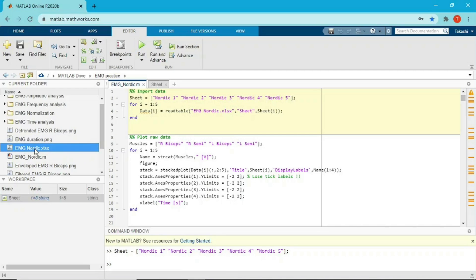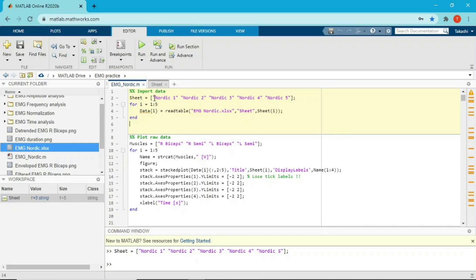The first input argument — whenever I say input argument, it's something inside the brackets after the function, separated by commas. The first input argument is the name of the Excel file: 'EMG_Nordic.xlsx', the same name as it appears. You have to put double quotation marks — it could be single quotation marks, but you need them so MATLAB recognizes it as a name. If you remove the quotation marks, MATLAB might think it's a function or a variable you created.